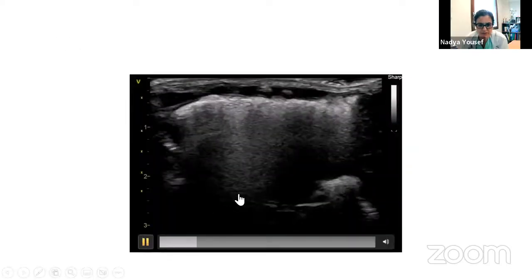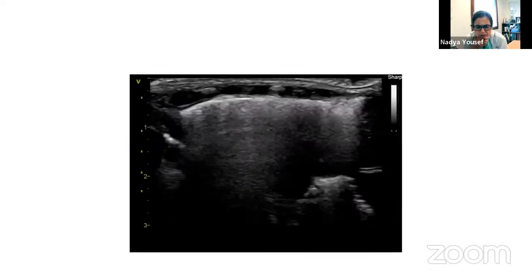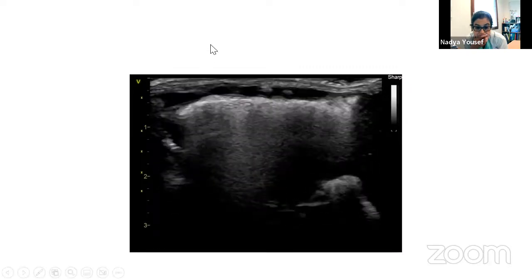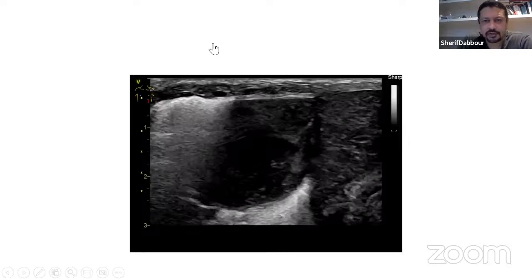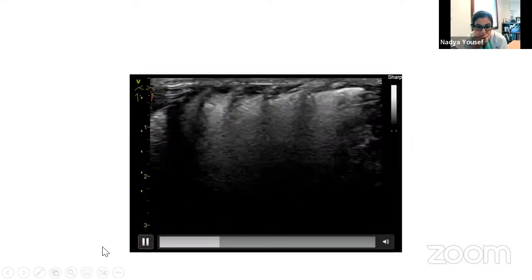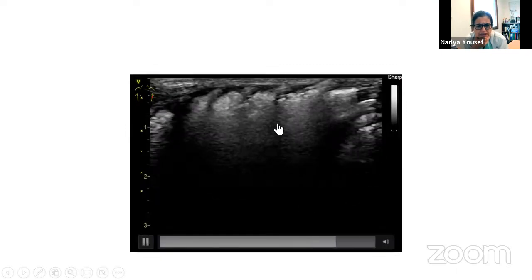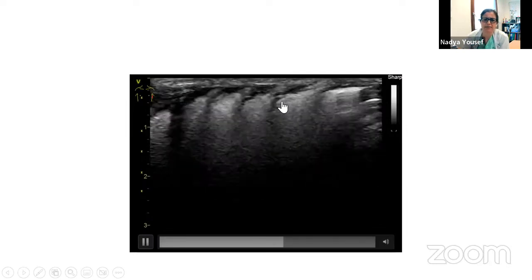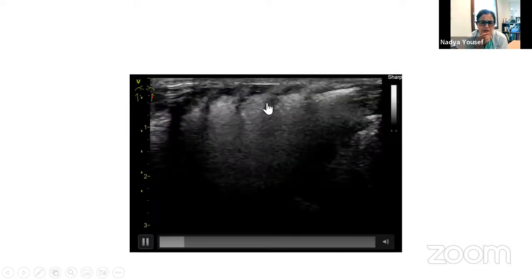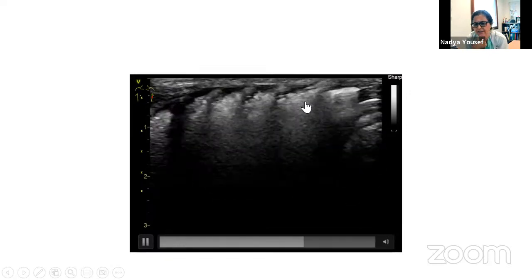If the question is for me, I can't see any bronchograms at all, but okay. Yeah, I got you. That was the last one on the left. Do we see any bronchograms? Yeah, there are some tiny bronchograms indeed. But I think, maybe on the left side, maybe further to my left of the screen. Impossible to say. They're tiny, tiny.